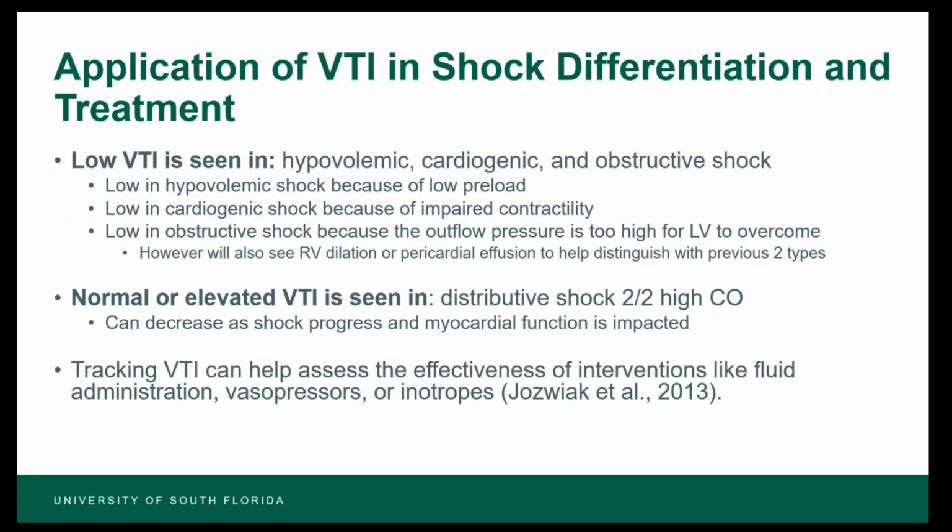Yeah, so this is Bianca Sanchez. Just to recap what we've gone over so far before we get into the actual application of everything, we've discussed what VTI is, how it's a measure of the stroke volume, or the amount of fluid being pumped out of the heart. We figured out how we're supposed to obtain that through our point of care ultrasound at the bedside. And Dalan did mention the context we need to keep in mind when obtaining our VTI measurement and also interpreting it, applying the clinical context. And then he did start to touch on the application of it in terms of fluid responsiveness and how we can use VTI to see if what we're doing is actually affecting the patient and how it's affecting the patient.